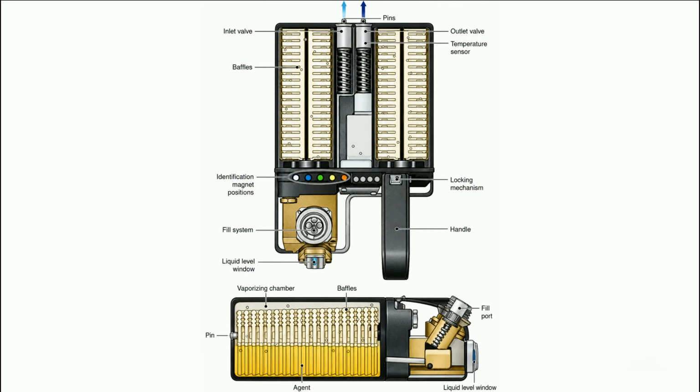So an easy way to look at this is that with the TEC vaporizer, the vaporizer itself mechanically controls the splitting ratio. In the Aladdin cassette, the workstation electronically controls that splitting ratio. The cassette provides the agent specific vaporizing chamber. So all it is, is a chamber containing the wicks and the liquid. Everything else is done by the electronic workstation. Crucially, there is no bypass channel in the vaporizer itself, and that is why the device can be carried around without the problem of tipping. It is merely a reservoir and a vaporizing chamber.